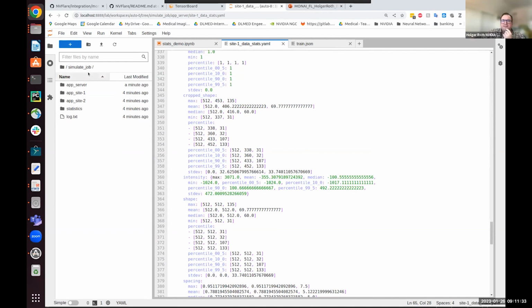Yeah, there are different security settings that you can set up in NVFlare. Of course, each FL framework might handle this slightly differently, but you can either allow code being shipped as part of the bundle that is distributed through the server, or you cannot allow it if you're in a more security-strict setting. In that case, maybe you need a separate approval process and to install the code on the clients, so it's available to be run through the configurations.